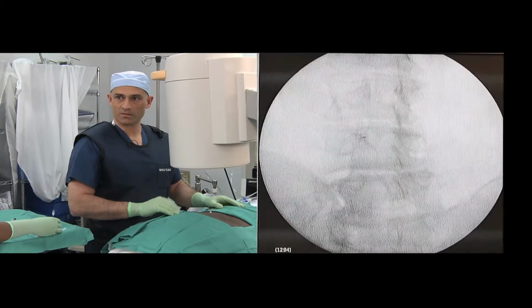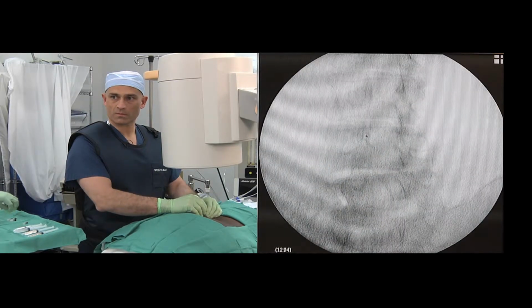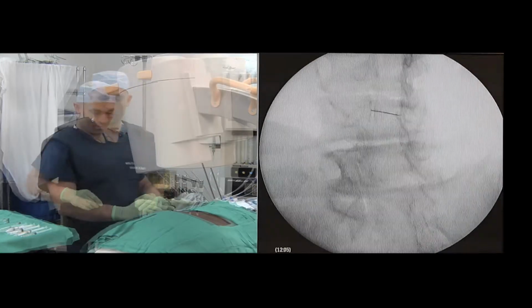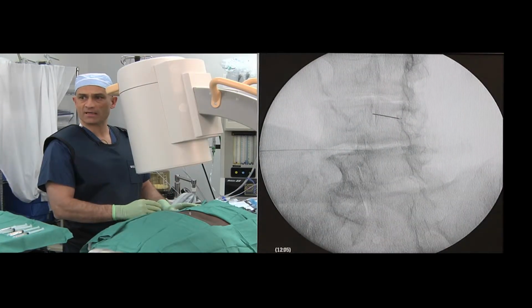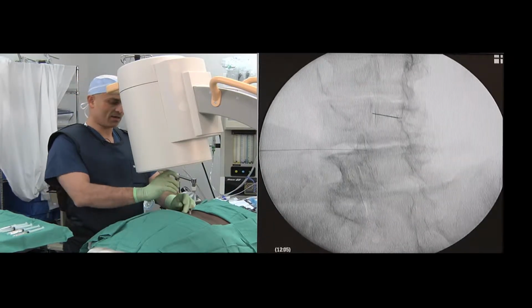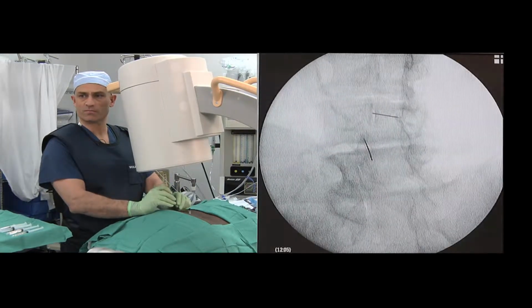I need some longer needles. The needle is then advanced into the joint. The level below is then addressed using the same fluoroscopic technique. The needle tip is placed over the joint space and advanced under fluoroscopic guidance into the joint.